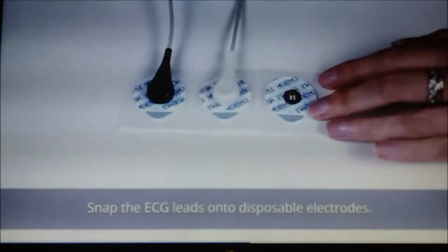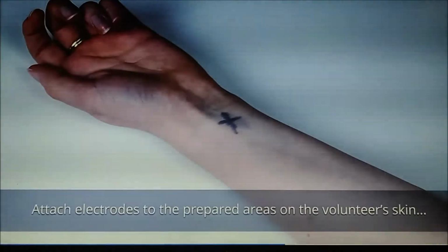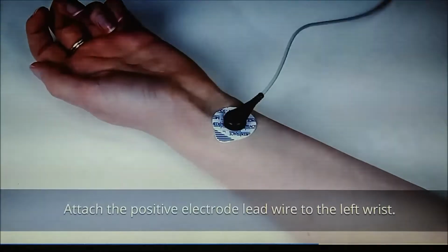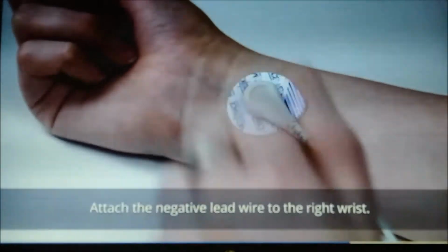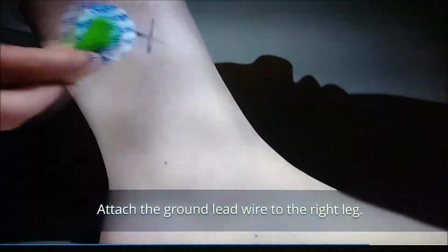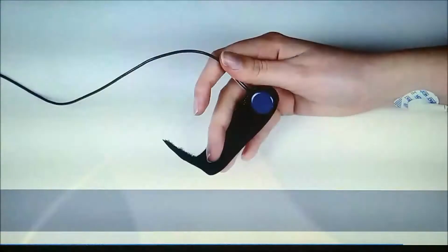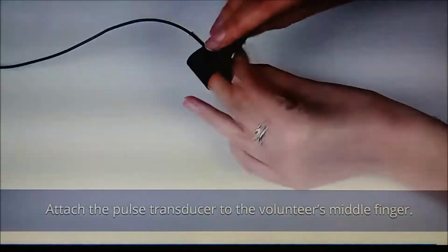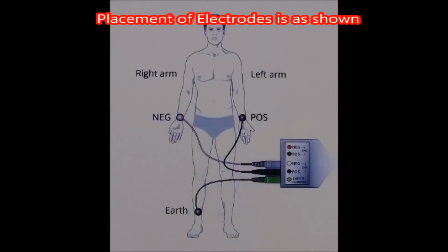Snap the ECG leads onto the disposable electrodes. Attach electrodes to the prepared areas of the volunteer's skin. Attach the positive lead to the left wrist. Attach the negative lead to the right wrist. Attach the ground lead wire to the right leg. Attach the pulse transducer to the volunteer's middle finger. Placement of electrodes is as shown.